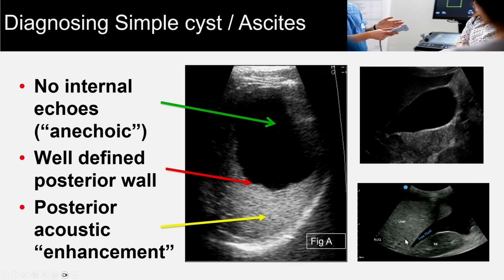Here you see a pathologic view, a sagittal view through the right upper abdomen in the midaxillary line. You can see the liver and the kidney, and this patient has been in a trauma, and there's ascites or free fluid throughout the peritoneal cavity from visceral injury. So this patient has ascites, and one has a gallbladder that's filled with bile.